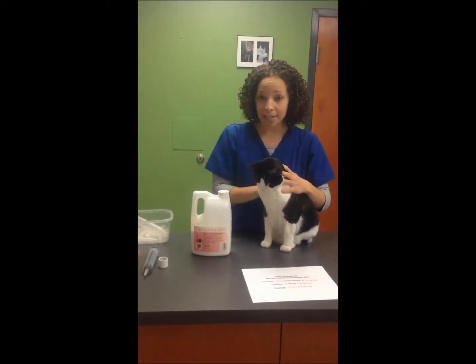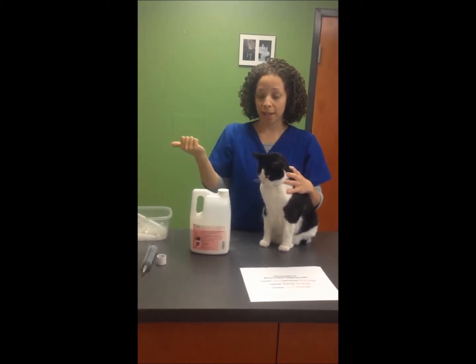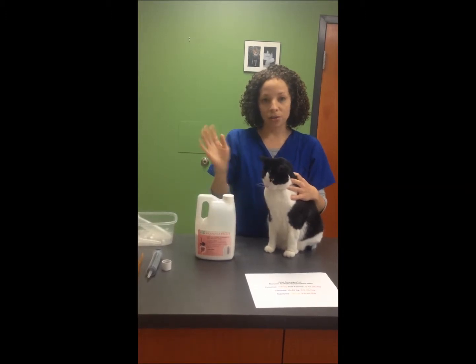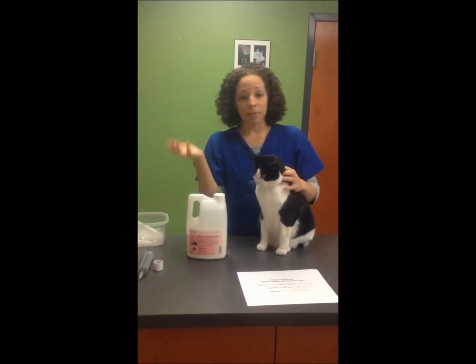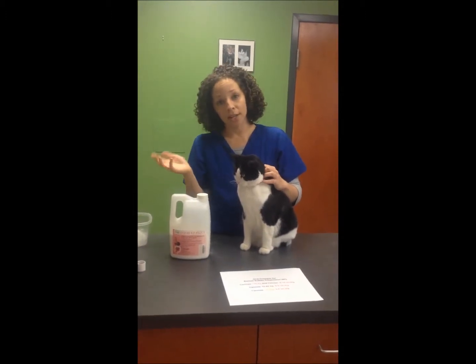So we are going to go ahead and take a break. We're going to get all of our PPE on for taking our radiographs, because the first place to start is to get survey radiographs of your patient, both lateral and VD, because sometimes those can honestly be diagnostic enough to eliminate the need for you to do a contrast study.